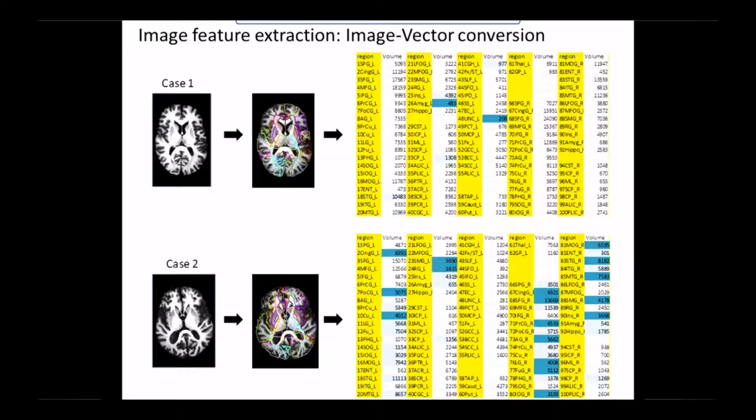Once we do this, we get out this Wall Street ticker tape here on the right. You put your brain in and you get out, in yellow, every region. There are 400 of these regions, and you get out the volume and other statistics associated with different modalities. T1 may give you volume, but DTI gives you 3 orientations, and T2 might give you a contrast associated with stroke and various things like that.